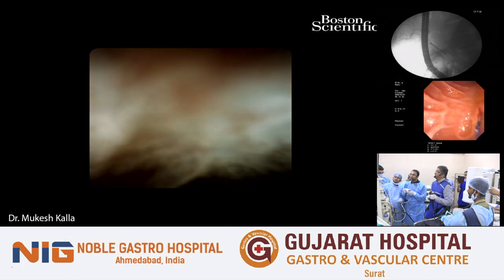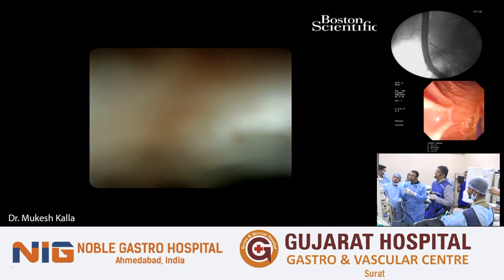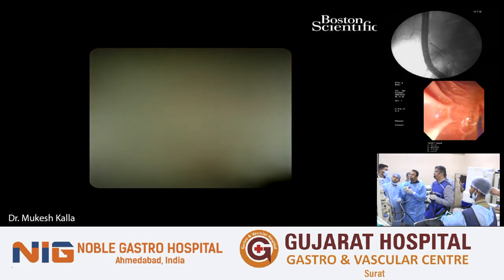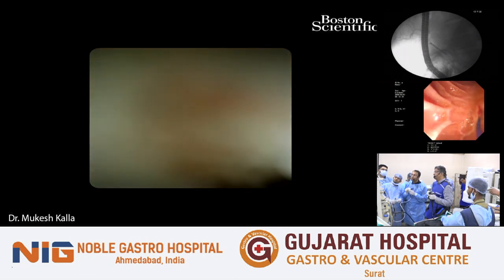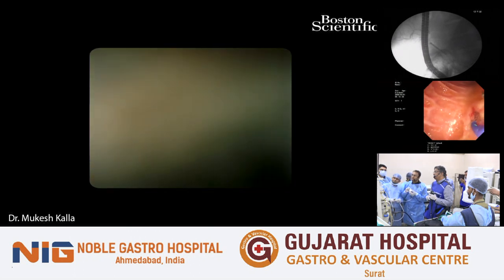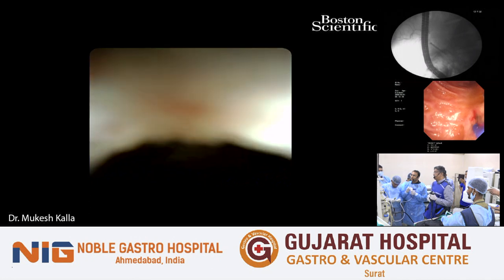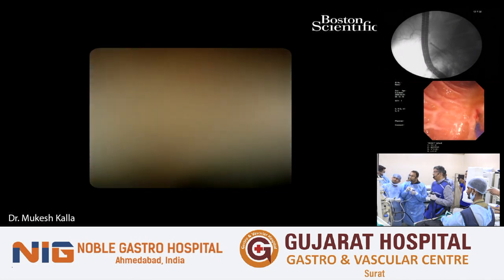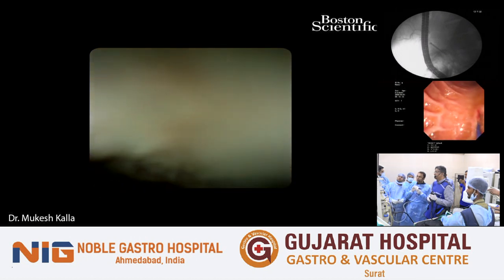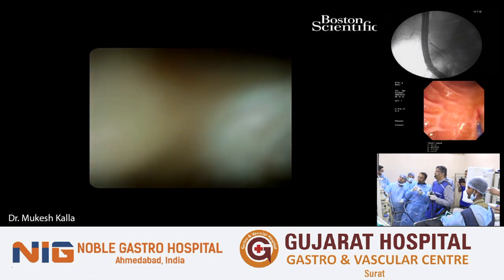Another thing which I try: don't use the shaft too much when doing a large laser lithotripsy. I use the up and down knob to go close and come a little away from the stone, which reduces the stress on the cystic duct and on the shaft of the cholangioscope. I think the cystic duct appears empty. Move it around.